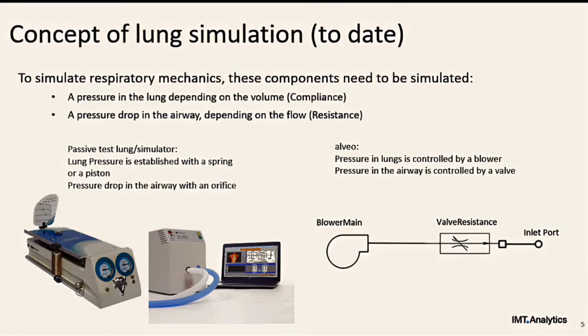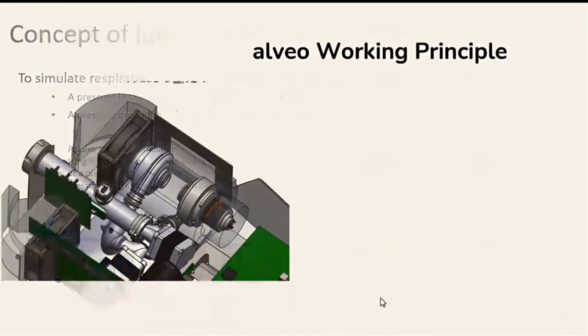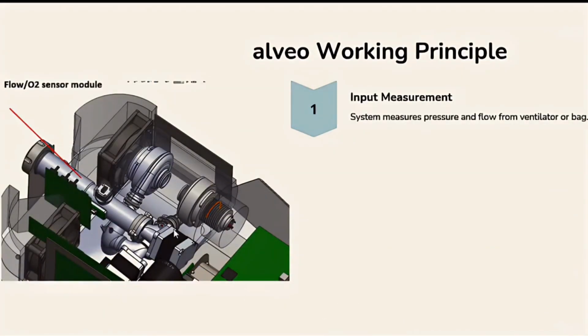The air is not contained in the simulator. That makes it possible to build this very compact. The air goes out to ambient.